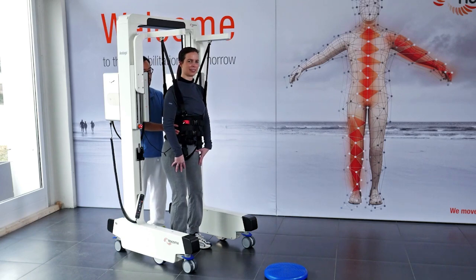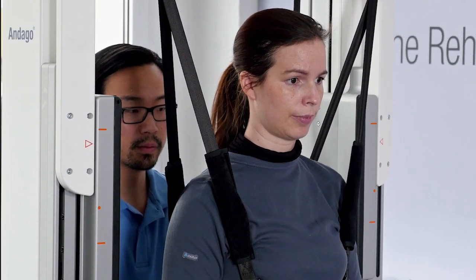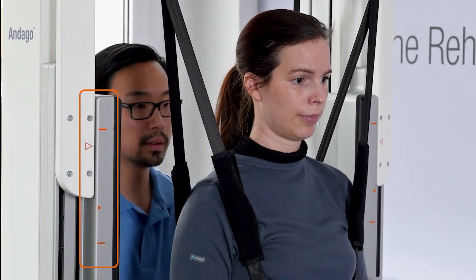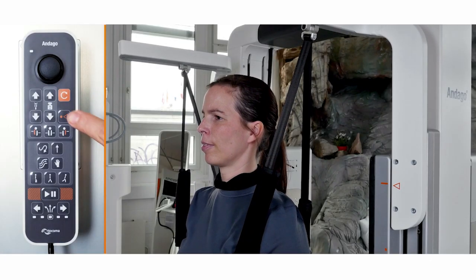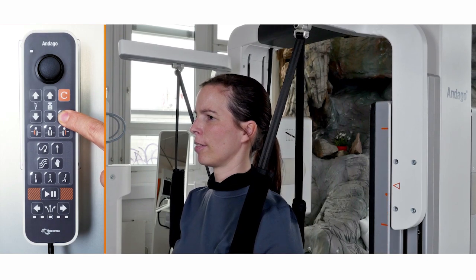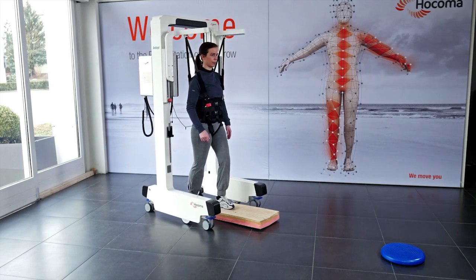The fall limit controls the amount of vertical displacement before the patient reaches the safety limits of Andago. You can identify the fall limit by looking at the distance between the arrow on the suspension carrier and the mechanical limit indicators. By pressing and holding the default fall limit button, your patient is able to walk on flat surfaces and able to step over or onto 13 centimeter tall obstacles.